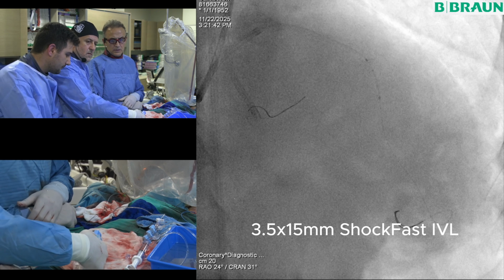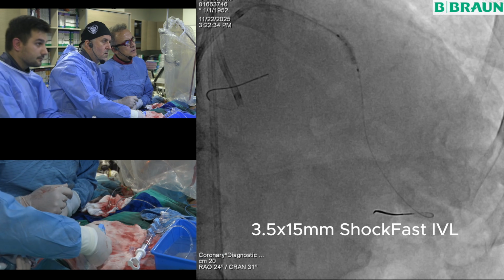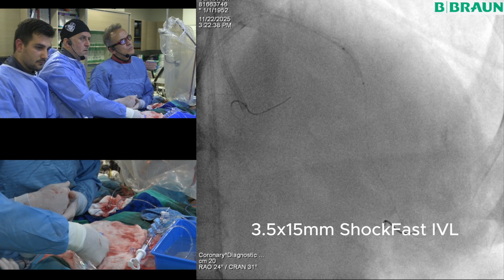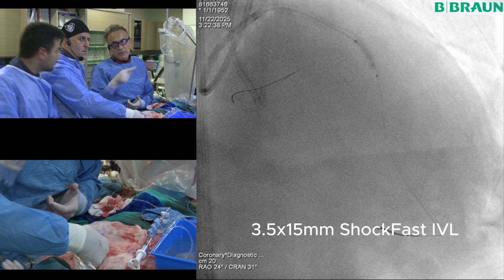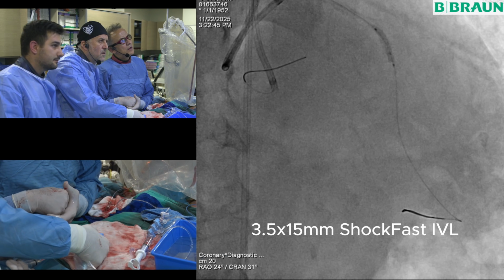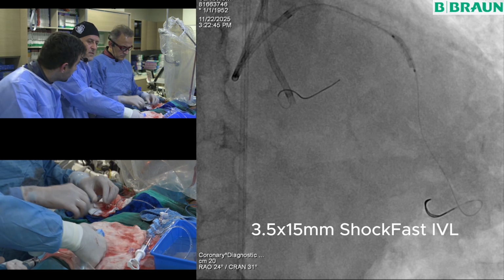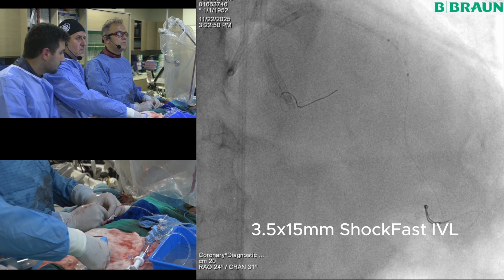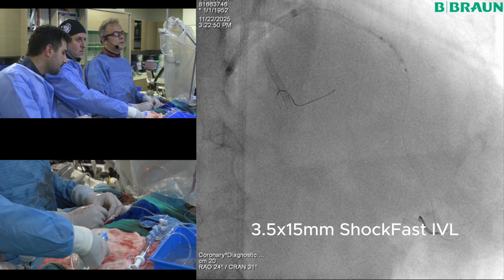Can I make a point here? At multiple points through here, I could see a lumen of less than 2 millimeters in what's a 3 millimeter vessel. That's critical. So the angiogram, I think, is lying to me. Misinterpreting the angiogram. But there has been perfusion imaging, hasn't there? So I think I would need, if I don't believe the IVUS, and I'm wondering if this needs treating.